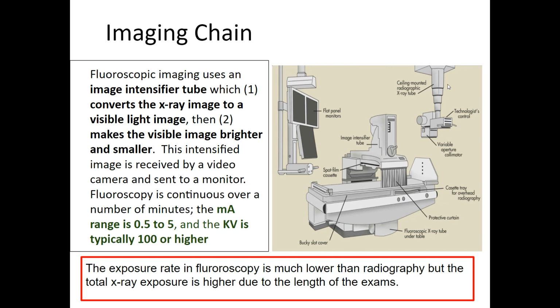So a lot of these rooms have a regular x-ray tube in them, but we move this thing to the side. We move it out of the way in most GI work that we do. Occasionally we move this tube back in front after the fluoroscopic procedure. Sometimes we do what's known as overheads. Has anyone seen some of the techs do some overheads? Technically, a lot of that doesn't get done anymore because the radiologist can see what they want, and because it's live, they can get just the perfect obliquity.